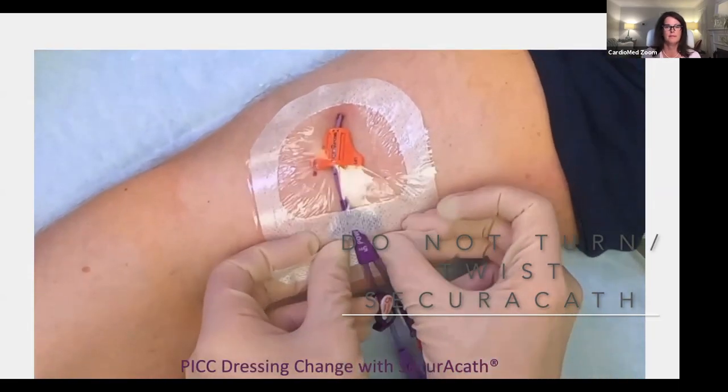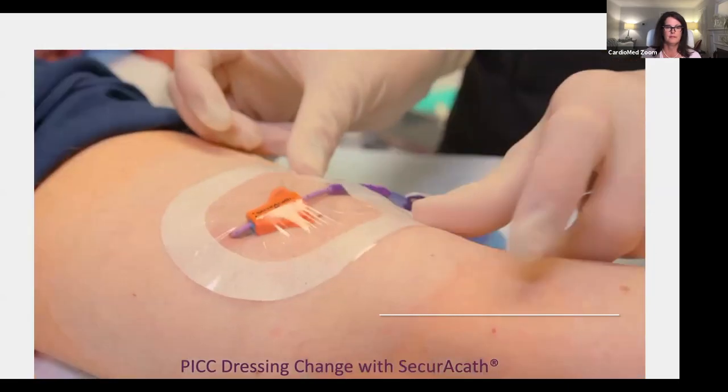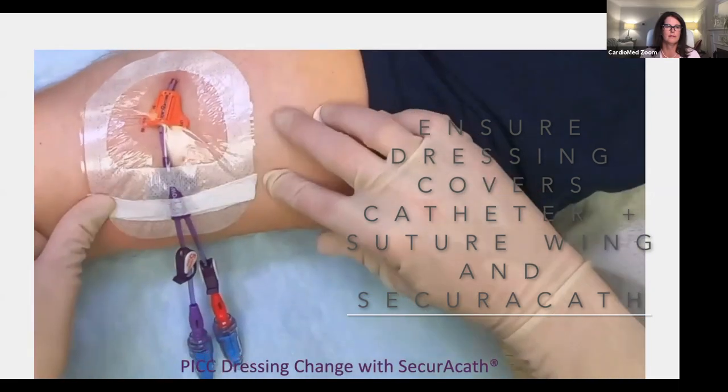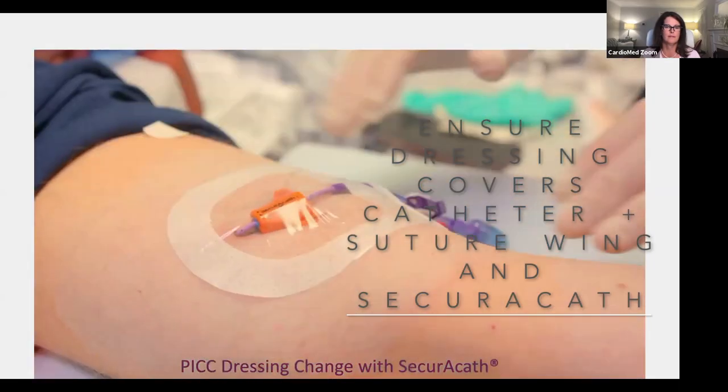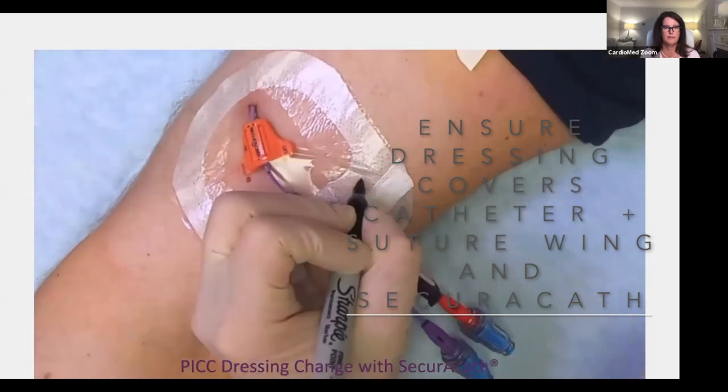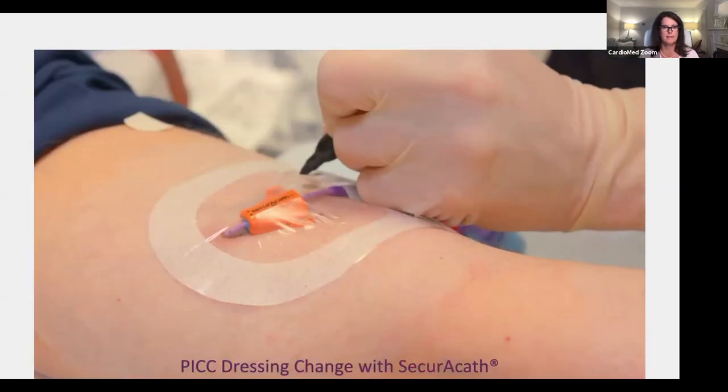Be sure to cover the insertion site, the SecurAcath, and any external portion of the catheter up to the extension tubes with the transparent dressing, as this will prevent pulling or kinking of the catheter. There is no need for an adhesive securement device when the SecurAcath is in place.